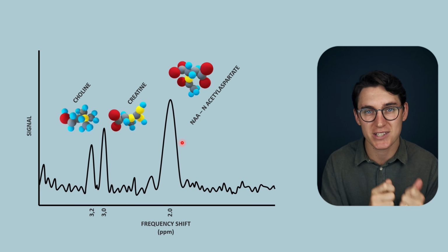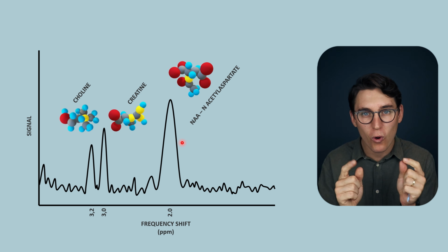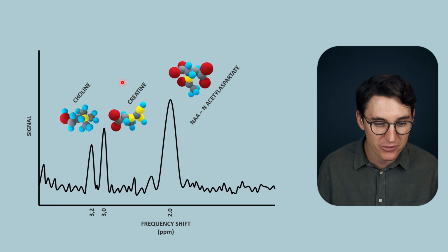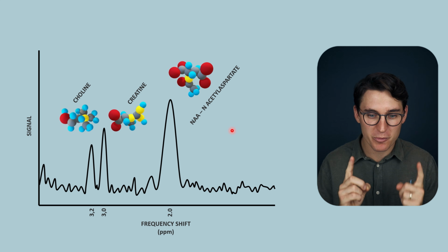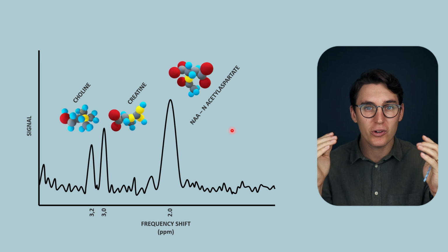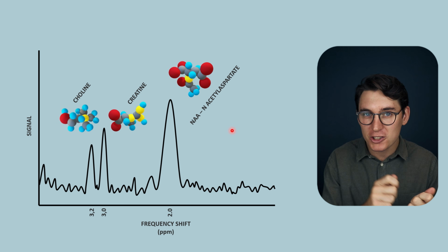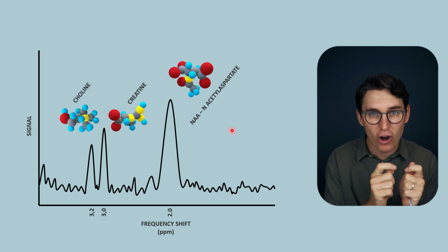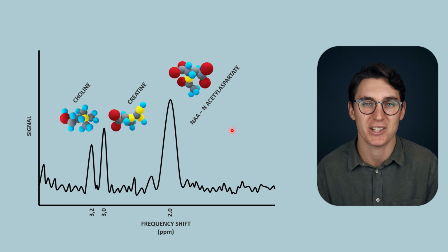And there are multiple different techniques that we can do. We can use inversion recovery, saturation bands, or a chemical shift selective sequence to prevent that signal from interfering with these much smaller signals coming from metabolites. Now, important to remember, MR spectroscopy is not only for neuroimaging. We see it in breast imaging, prostate imaging. Multiple different subspecialties within radiology can utilize this, and often we are looking at different types of metabolites depending on the region of the body that we're looking at.